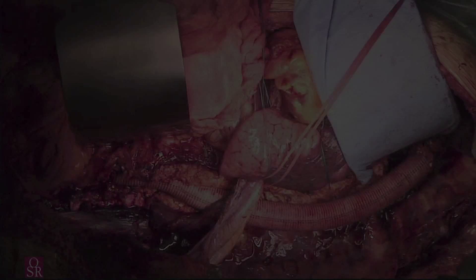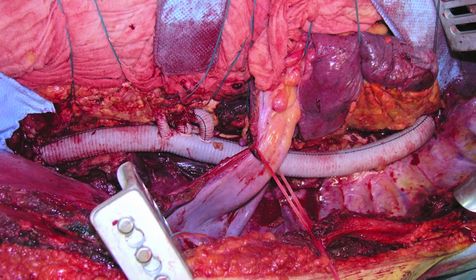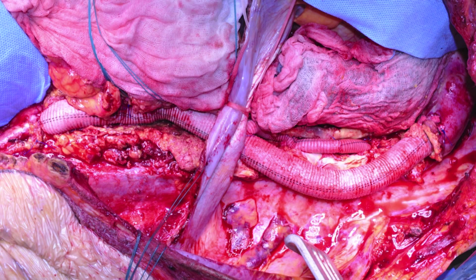Open surgical repair of thoracoabdominal aortic aneurysms has evolved significantly over the last decades, thanks to technical improvements, especially in the area of organ protection. However, despite adjunctive strategies, morbidity and mortality rates are still not negligible.